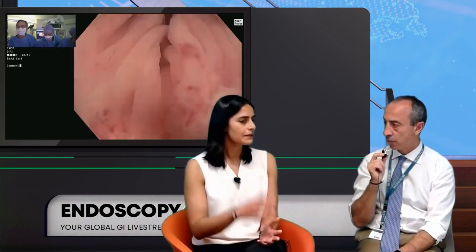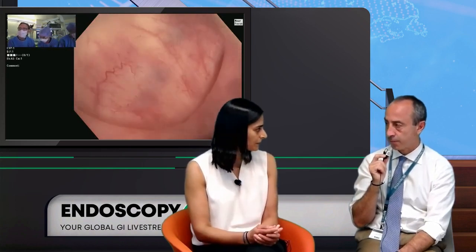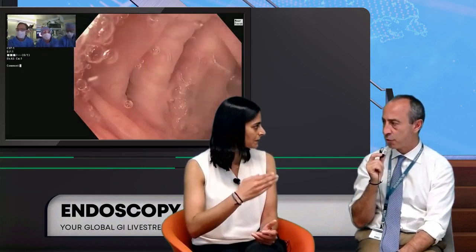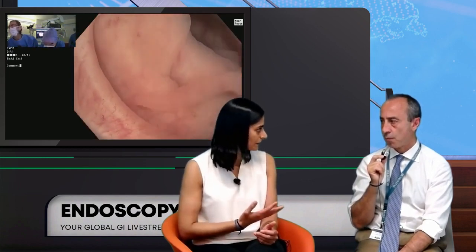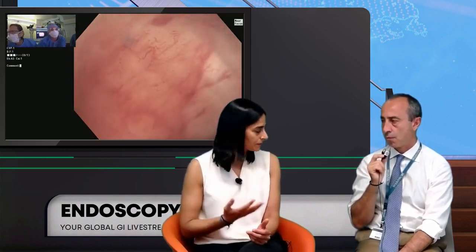Yes. The other indication for the device is for resection of mucosal neoplastic lesions. Very fibrotic is a great indication. So it really can cut the material and immediately capture it so you don't lose any of the pathology, and you're able to both resect and evaluate.